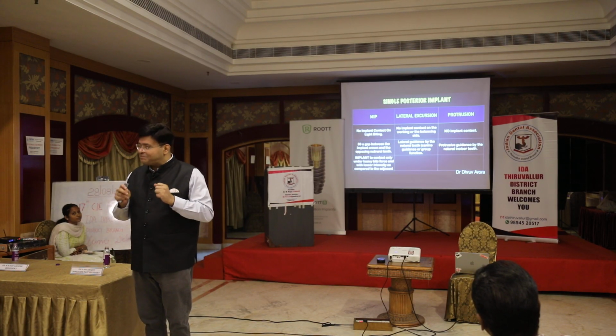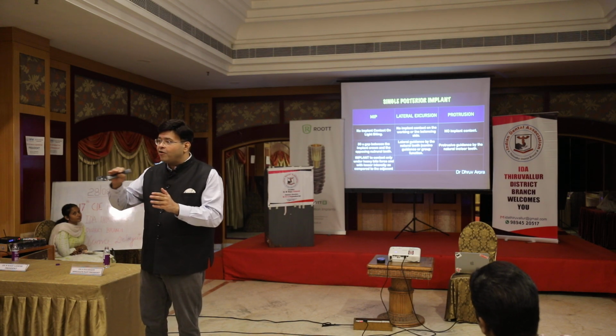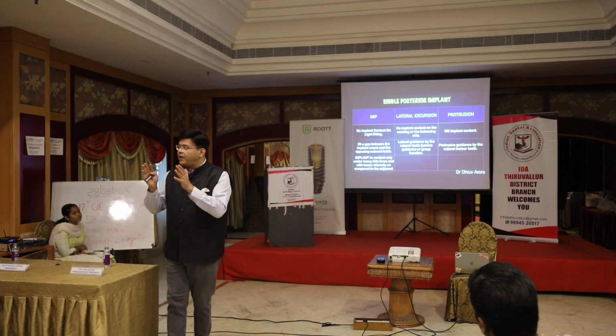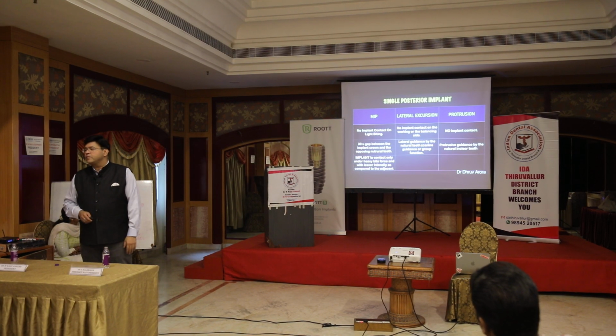But when the patient is biting heavily, at that time the implant crown should come in contact, but the intensity of color should be less. That is the light bite and heavy bite concept. No contact in lateral, no contact in protrusion.